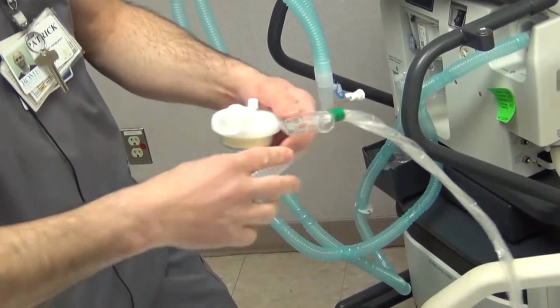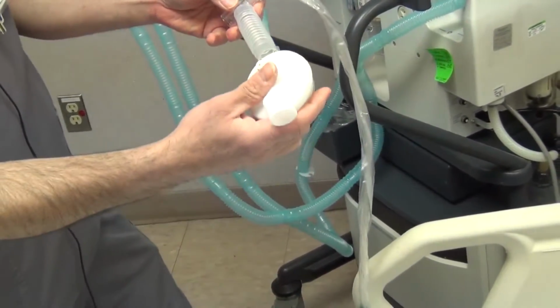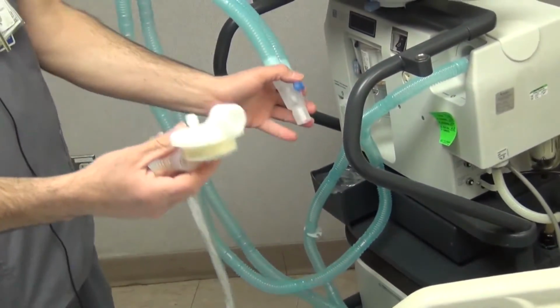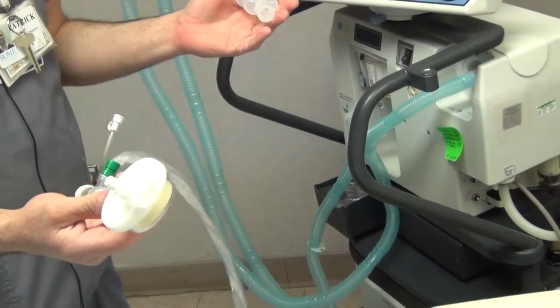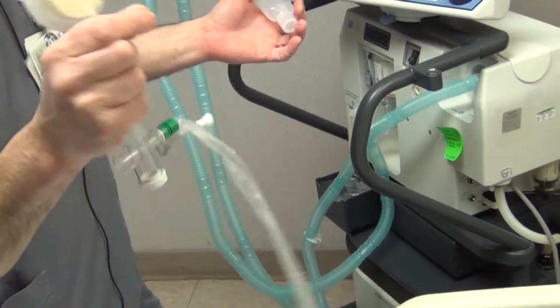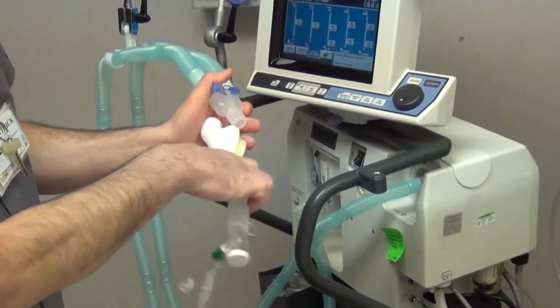Okay. So you'd put it together like so. There's also other supplies in the bag, including a nebulizer, a little MDI spacer to put medications in. But for initial setup, we're just going to do it simple, just like this for now.